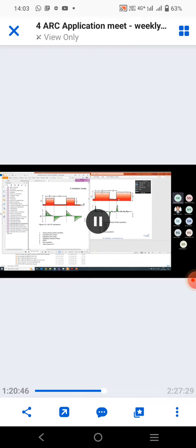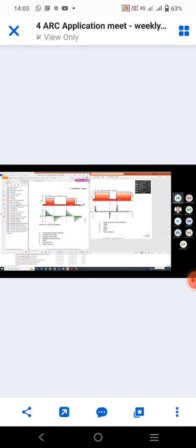But doctors haven't bought into the concept that if you have a patient who's really bad, then APRV mode is the mode for him. Then ask them how to use APRV mode. Oh, my senior has used it. I have seen that thing. See, to use an APRV mode, the fundamental thing is you don't want the lung to empty out completely, and you keep it pressurized for as long as possible for oxygenation to happen. So it is just like CPAP, and then just release the gas and then refill it again. Release the gas, refill it again.